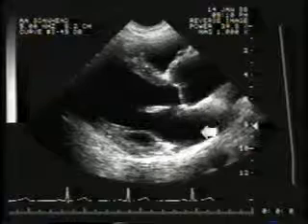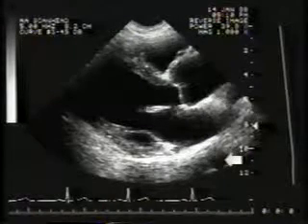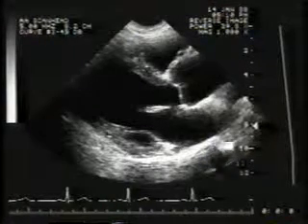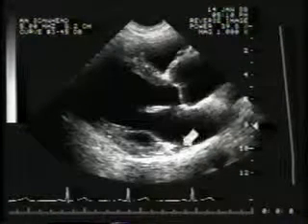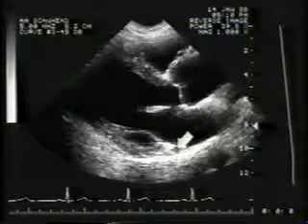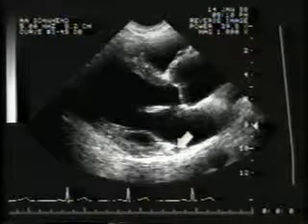The descending thoracic aorta is seen in short axis behind the left atrium. The coronary sinus is also seen in short axis here in the atrioventricular groove.